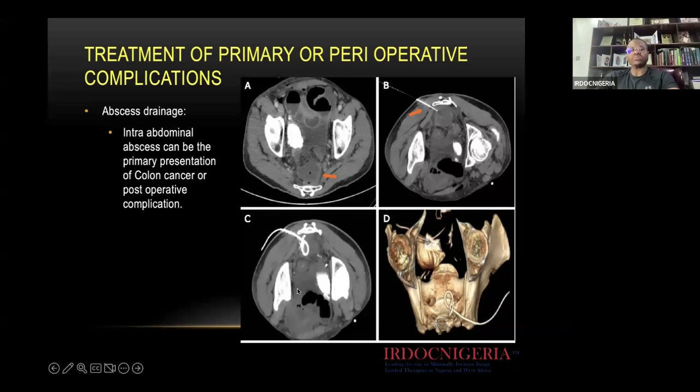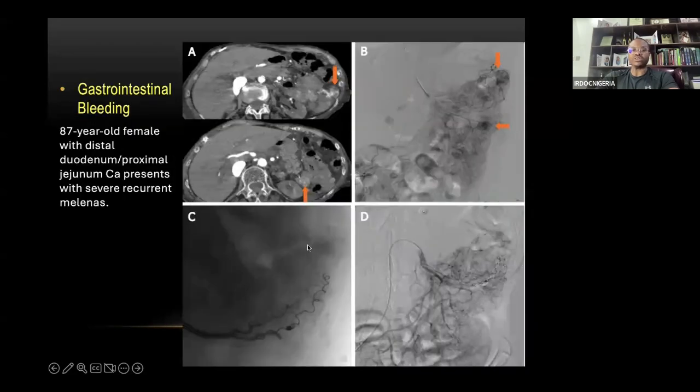Again, this is one such example of a patient who had a rectal resection with a Hartmann's pouch. And you can see that there's a presacral collection here that was an abscess. Instead of this patient going back to surgery for re-exploration, we can place a CT-guided drain, going through the sacral bone there, which is the avascular zone in this patient, and put a drain in to resolve that abscess without going back to surgery.